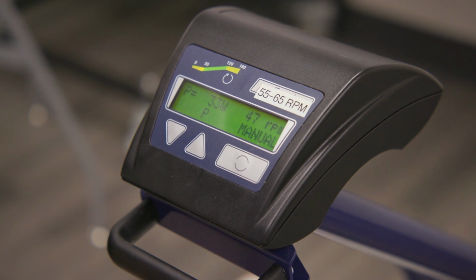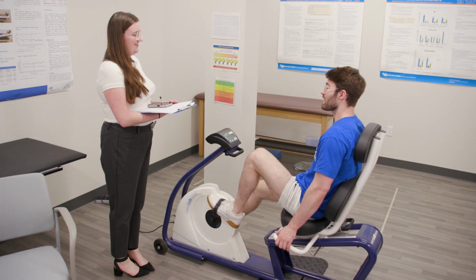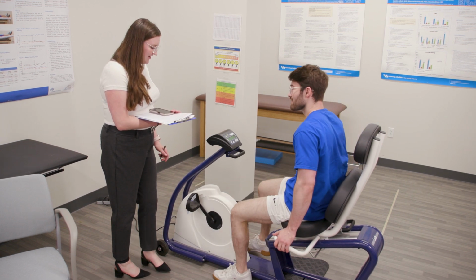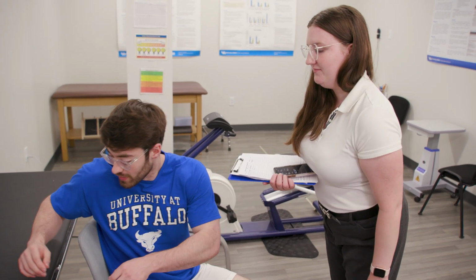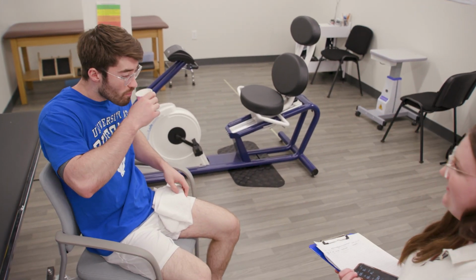To cool down, the patient should pedal at the slowest comfortable RPM. This is often approximately 30 RPMs, but it may vary. Heart rate, RPE, VAS, and any additional comments, if needed, are recorded after the 2-minute cooldown. Following the cooldown, the patient should rest in a chair in a quiet environment until symptom severity returns to the pre-BCBT value or the patient feels comfortable continuing with the remainder of the clinical visit. Provide water and a towel to the patient if needed. The BCBT typically lasts 10 to 15 minutes, including the 2-minute post-assessment rest.